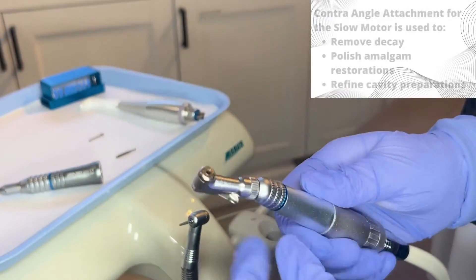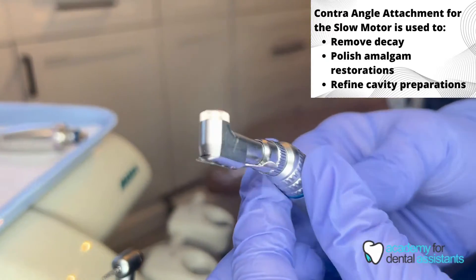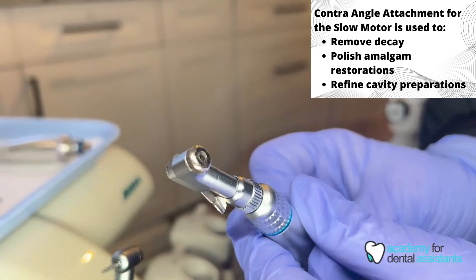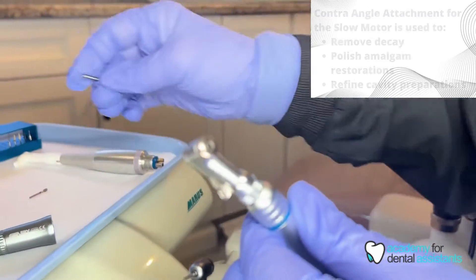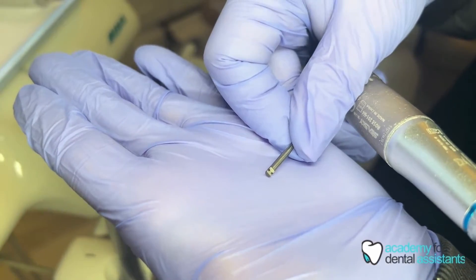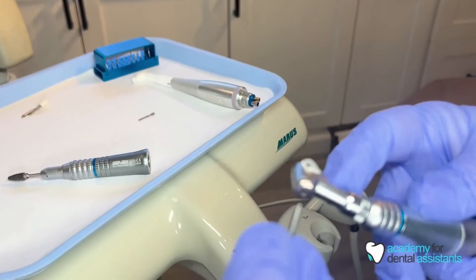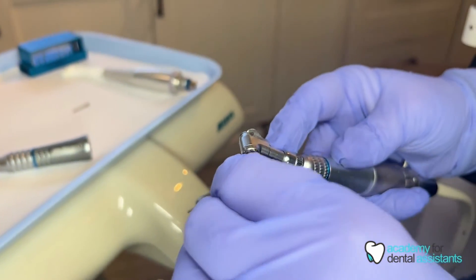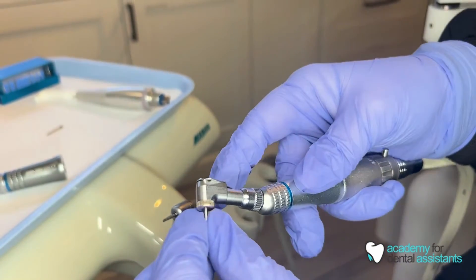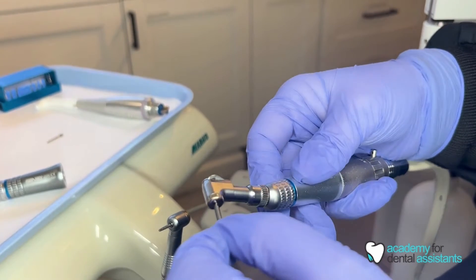When the latch in the back is facing parallel it is closed; when it's open to the side, it is open, allowing you to insert the burr. You would then take your latch-back type burr with a groove at the bottom and insert it into the contra angle hole. You would then close the latch to lock it in place — the latch will not close if the burr is not fully inserted.